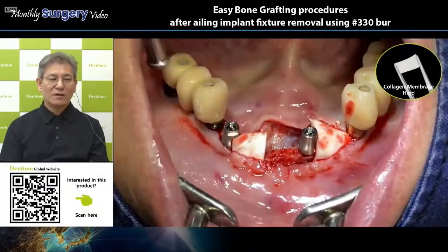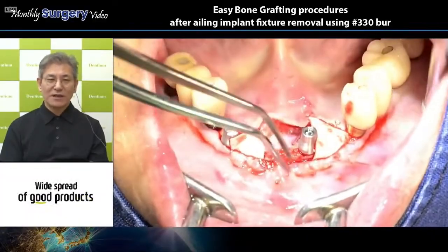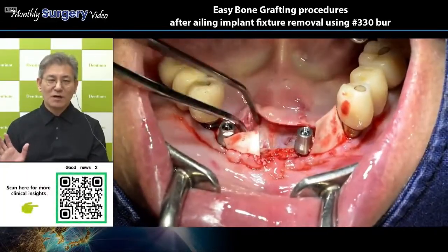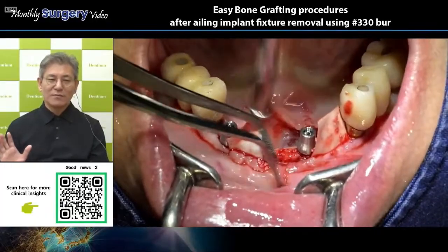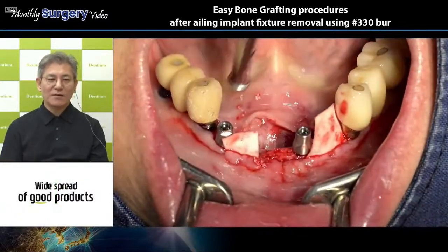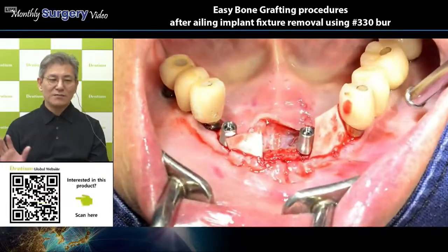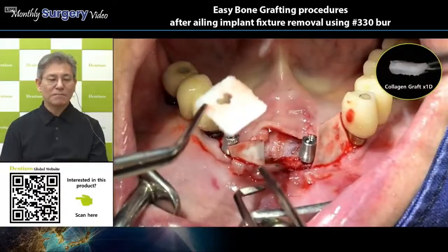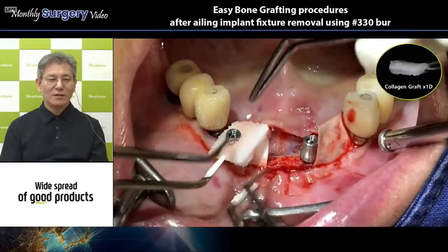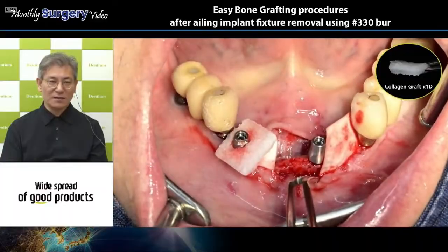However, sometimes just putting the membrane around the defected area is enough, because the stiff buccal flap holds the collagen membrane, and the stability is enough with this stiff flap tugging between the flap and bone area. In case of a 3-wall defect, like a contained defect like this, right?